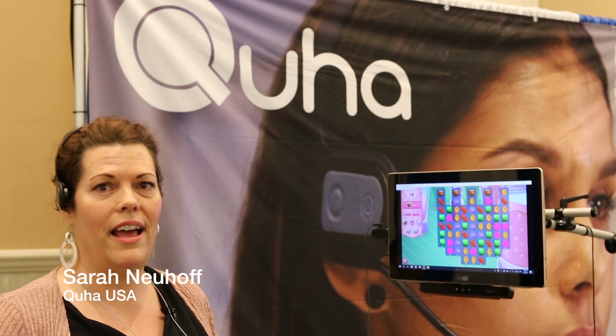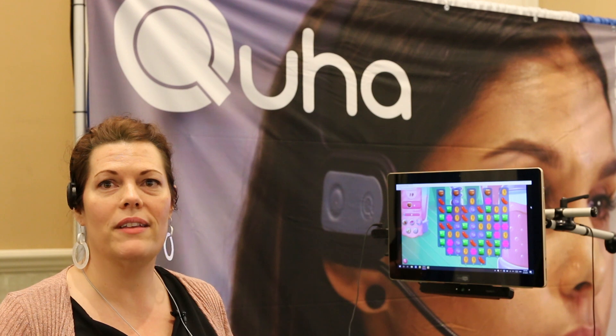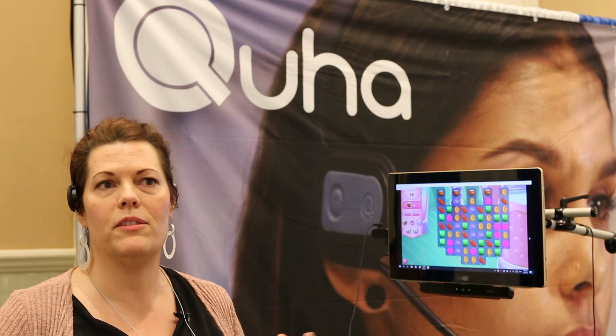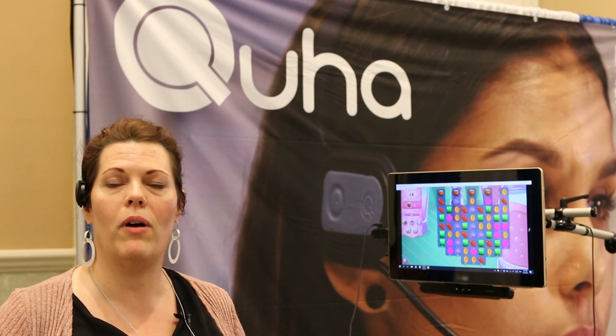Hi, my name is Sarah Neuhoff and I work with Quha USA. What we have is a gyroscopic wireless head mouse, and it's best known for working with spinal cord injury patients or ALS patients — people who have very limited movement who can't access their computer through a typical standard mouse.